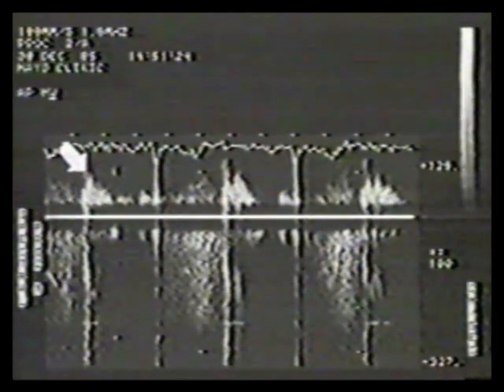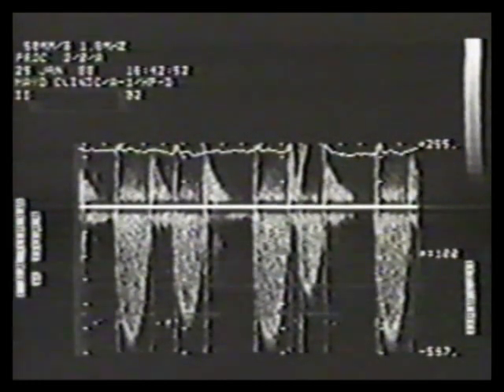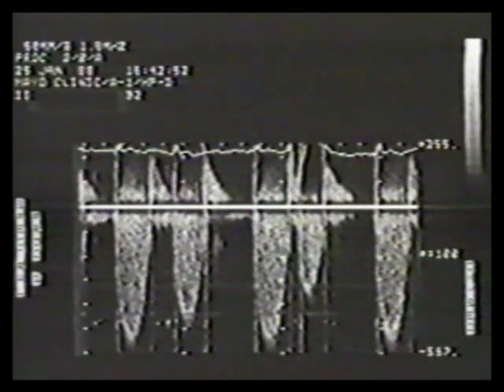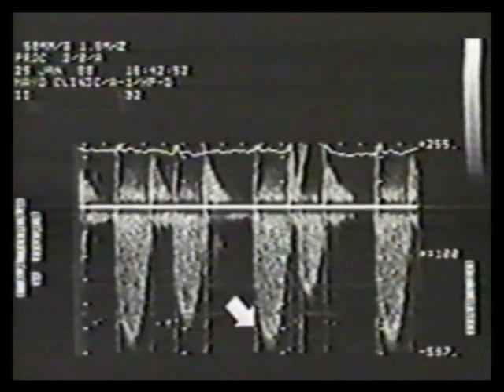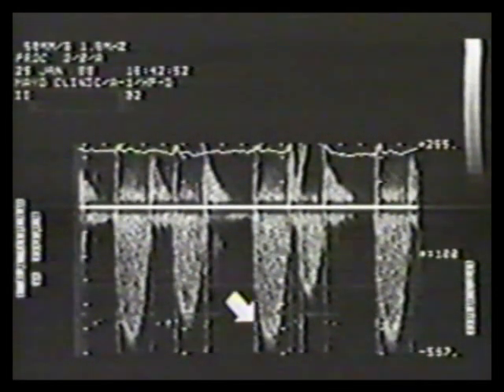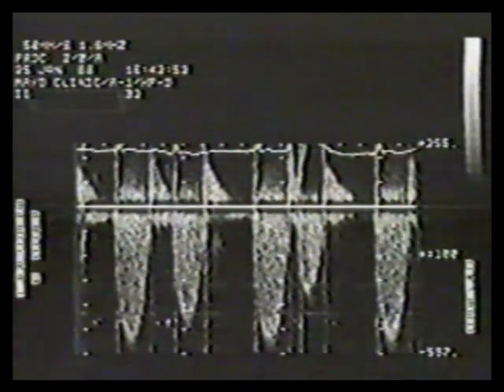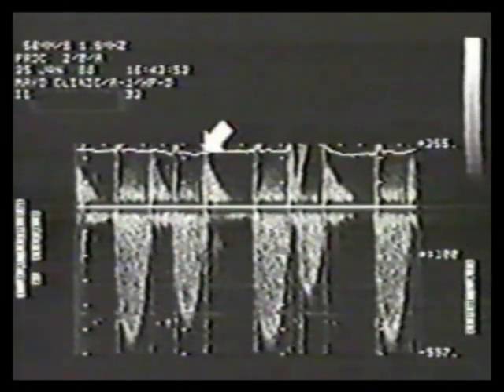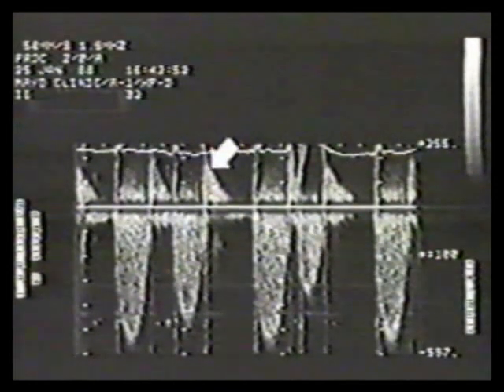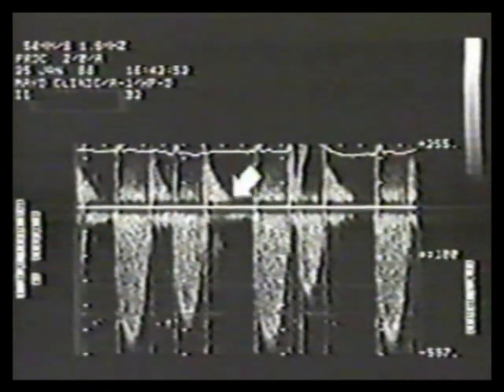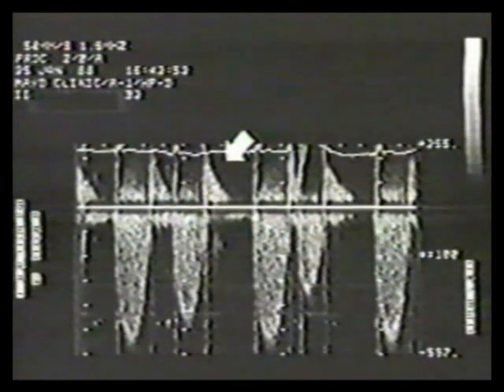Severe mitral regurgitation is usually accompanied by an increase in the forward velocity across the valve. This patient has a mitral heterograft prosthesis with opening and closing clicks evident. In contrast to the previous case, the mitral regurgitation signal is strong. Furthermore, the diastolic mitral velocity is increased to 2 meters per second with a normal deceleration time. This combination is indicative of severe mitral regurgitation.